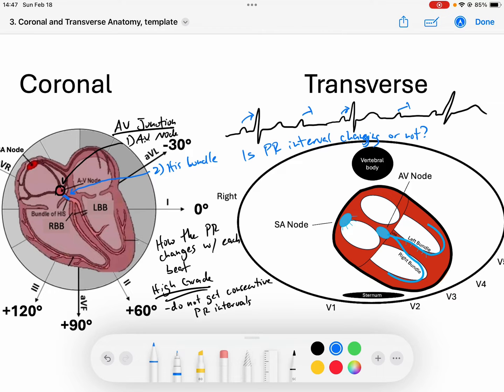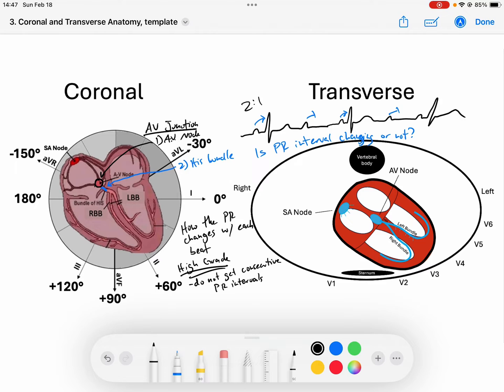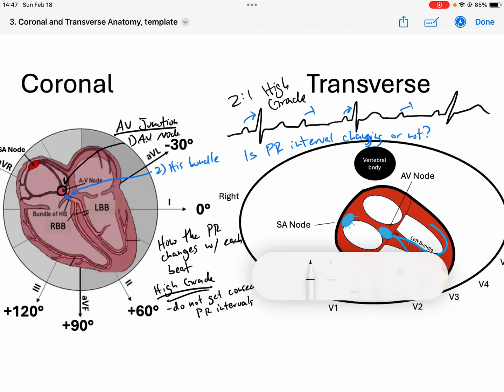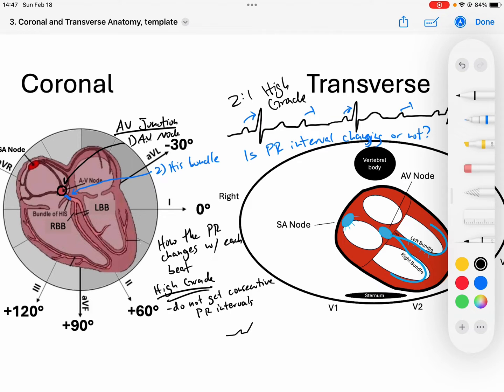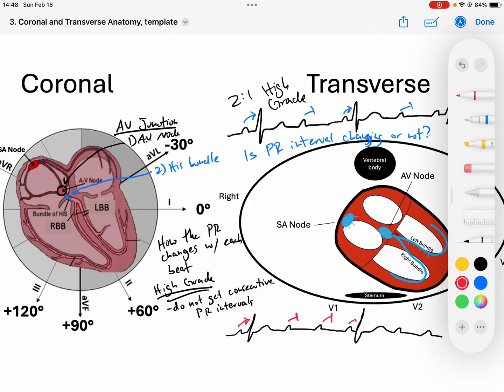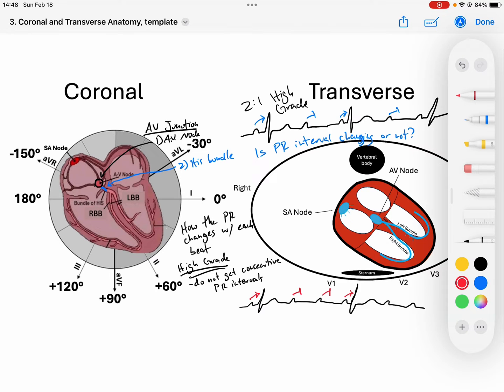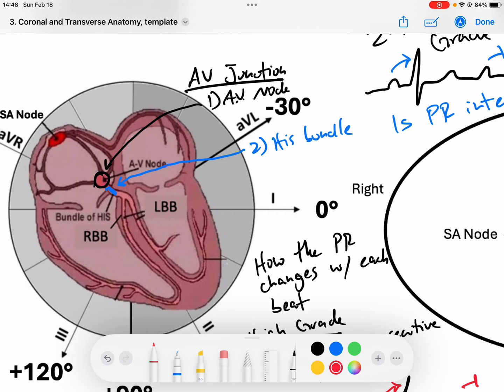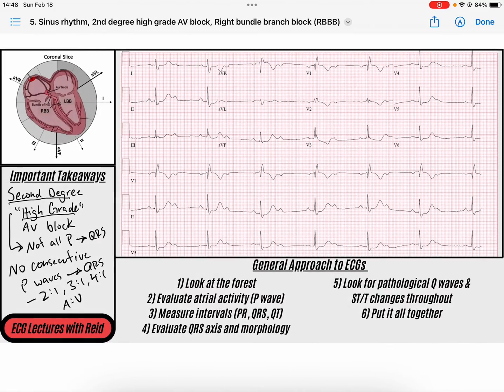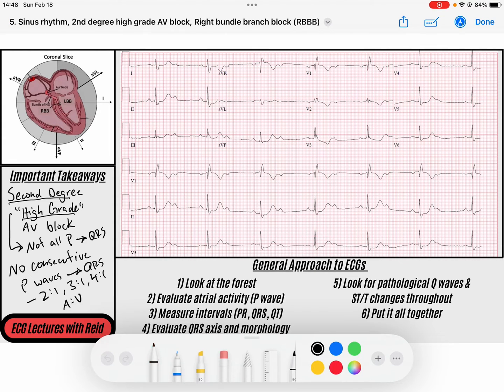That's an example of a 2 to 1 high grade block. A 3 to 1 would be: a P wave conducts to a QRS and T wave, then a P wave that doesn't conduct, then another P wave that doesn't conduct, then a P wave that conducts to a QRS. In these high grade blocks, we cannot determine if the disease is at the AV node itself or at the His bundle — it's impossible. So we must call them second degree high grade, not second degree type 2.